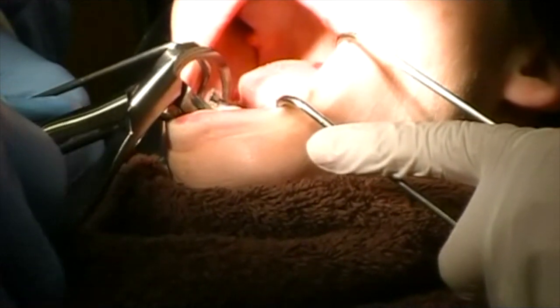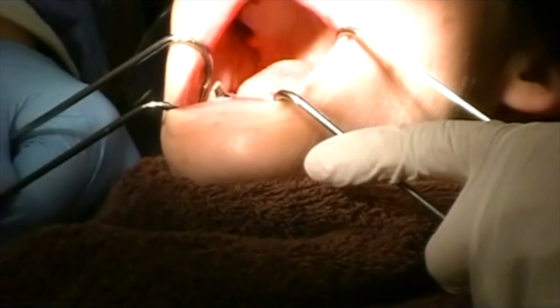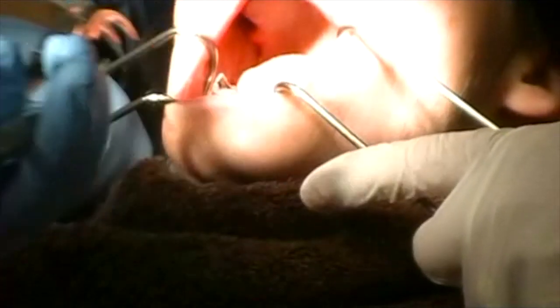You heard that little snap? Look at that — that tooth just broke apart, it's so rotted. Suction that little piece.